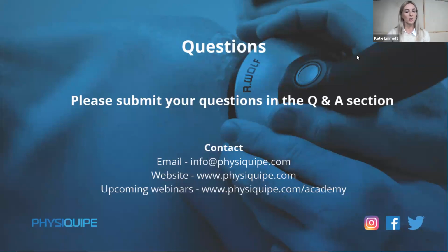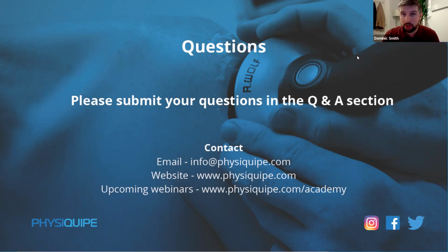So we've got a few questions come through from Dave. Dave has asked, hi Dom, if we are targeting a calcification at 15 millimeters, would you use the 10 or 20 cone or both? I use both. For anybody that is not familiar with what he's talking about, the gel pad on the system will have a number, and it's basically referring to the millimeters in depth that it travels. So 10 millimeters being a centimeter in depth. So when we talked about that focal zone, is this Dave Howells by any chance? It is, yeah. Hi Dave, I know he's joining us from Jersey.